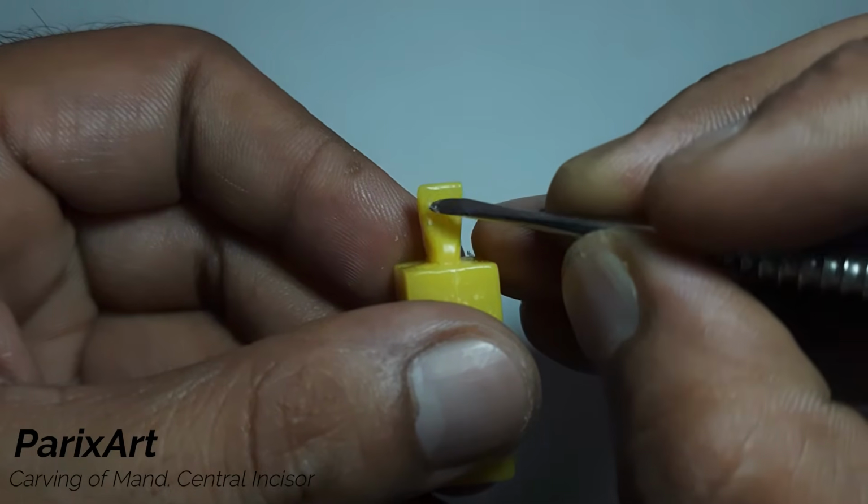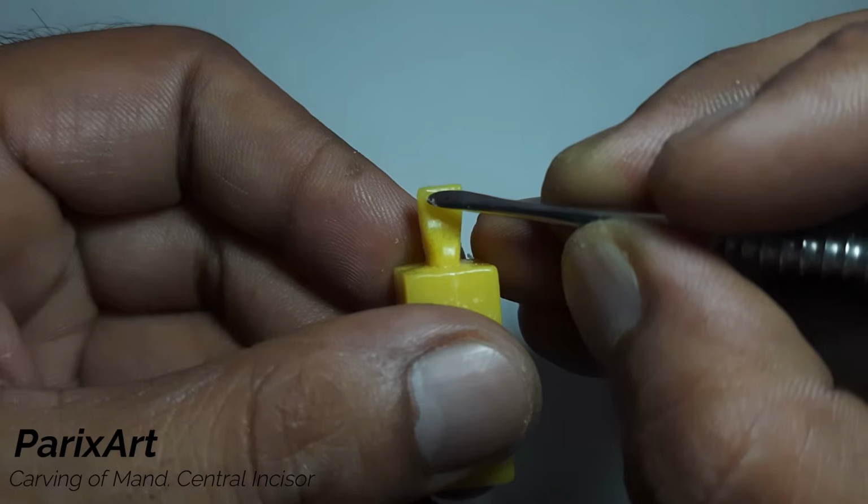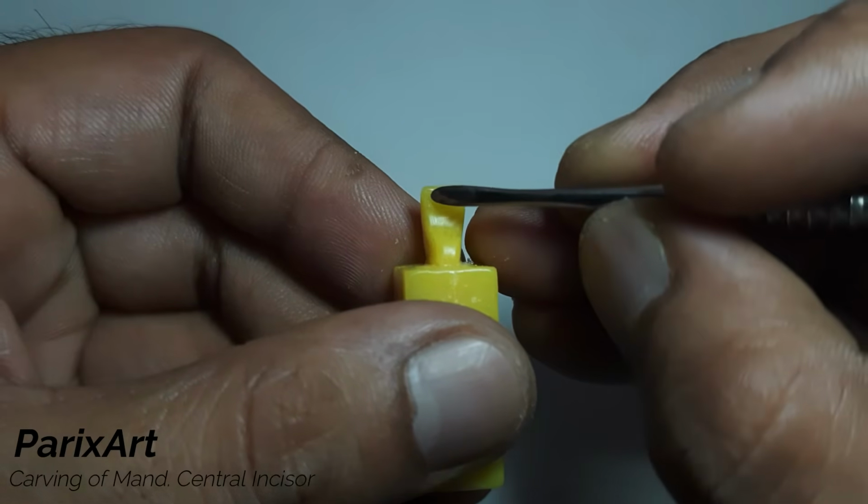Now what we'll do is, we'll just carve along the line angles to get the marginal ridge in the incisal third.